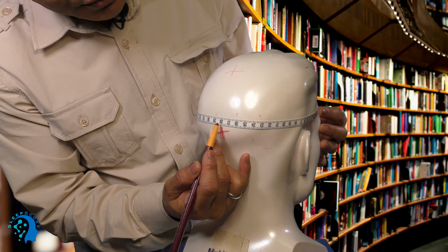So 5% means that half of 56, which is 28, and I go 2.8 right here, okay? Right here. All right. And then I go 2.8 on this side too, 2.8 right here, okay? So this is my 2.8.